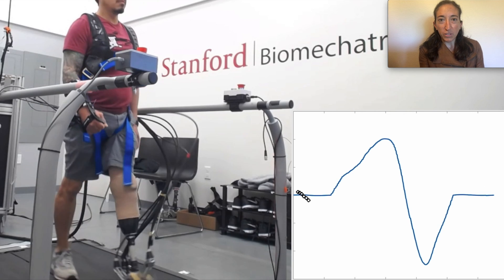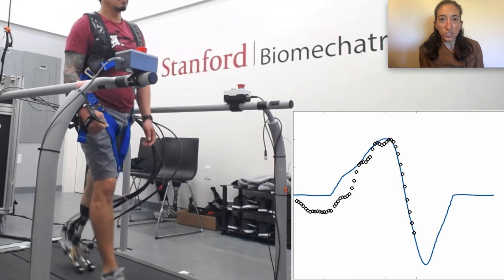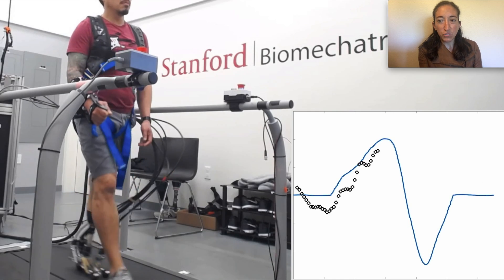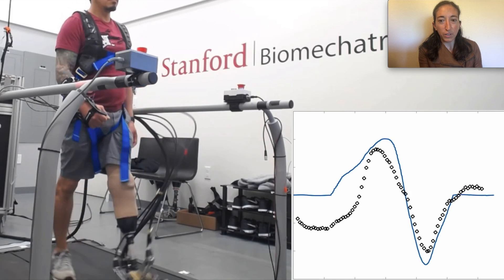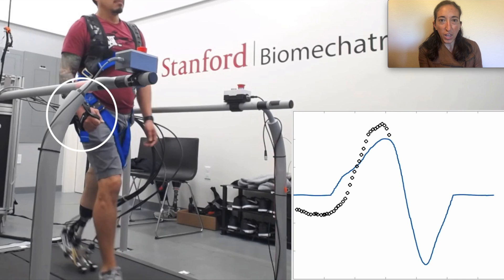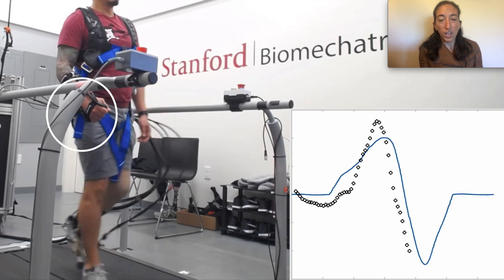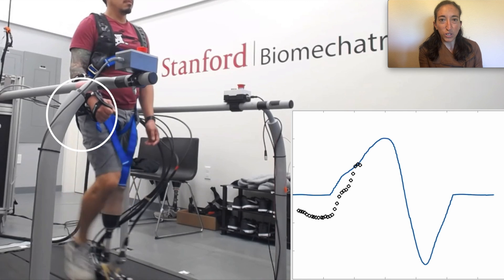We created a system that allows someone with a transtibial amputation to directly control their robotic ankle foot prosthesis with a wrist exoskeleton. This video shows a participant operating the device while walking with the prosthesis. The bottom right panel shows the desired trajectory that we gave the participant in blue, and how well he was able to follow this trajectory over time in black.